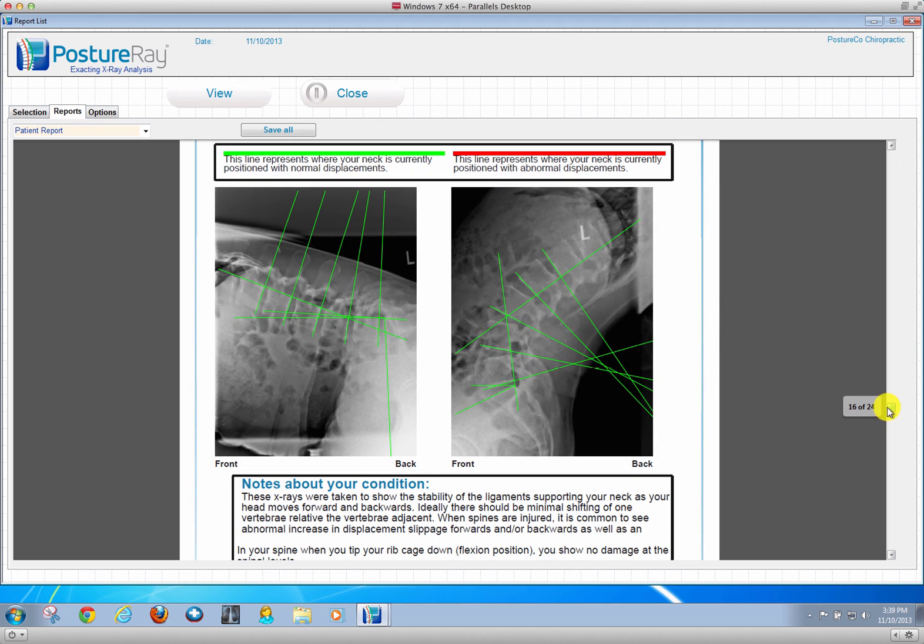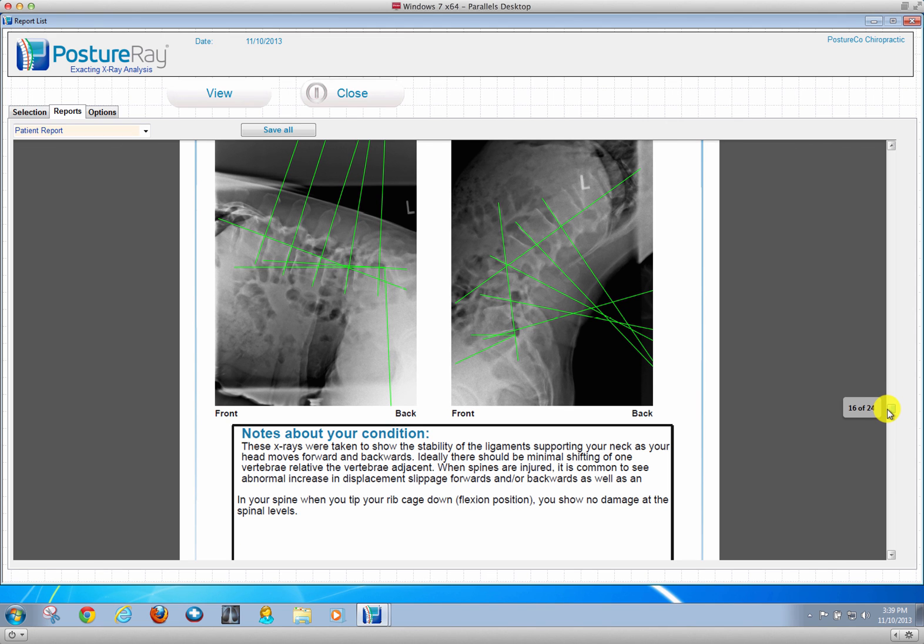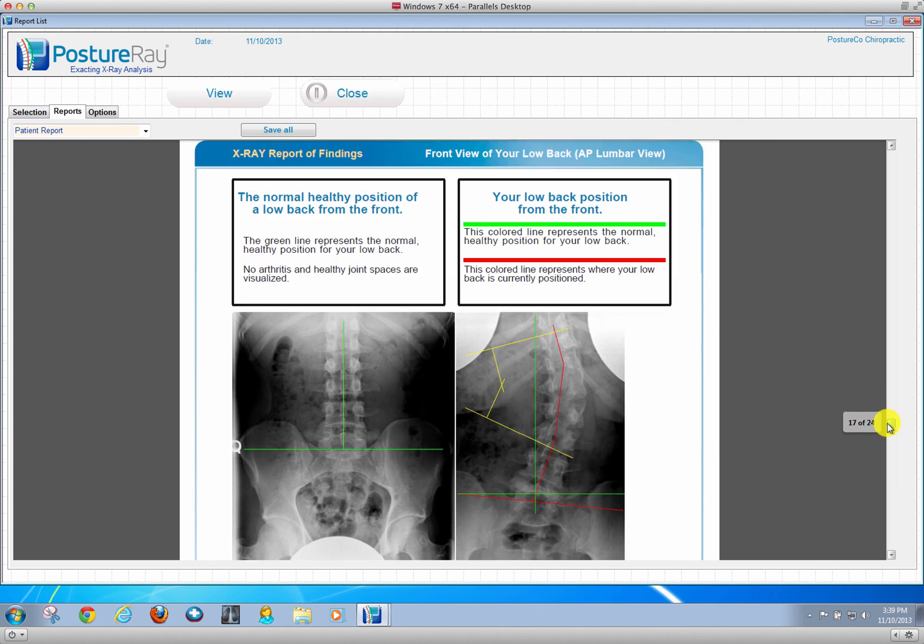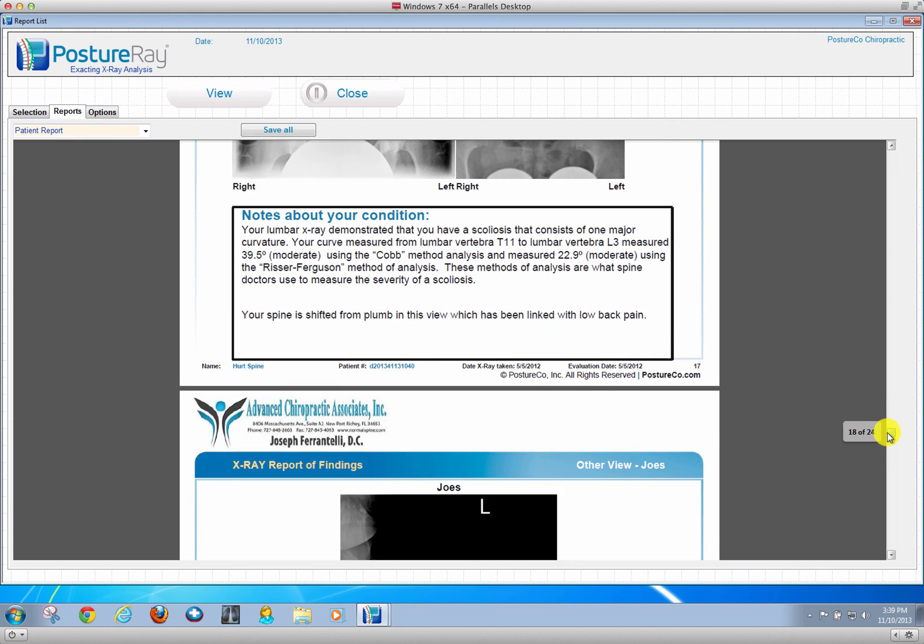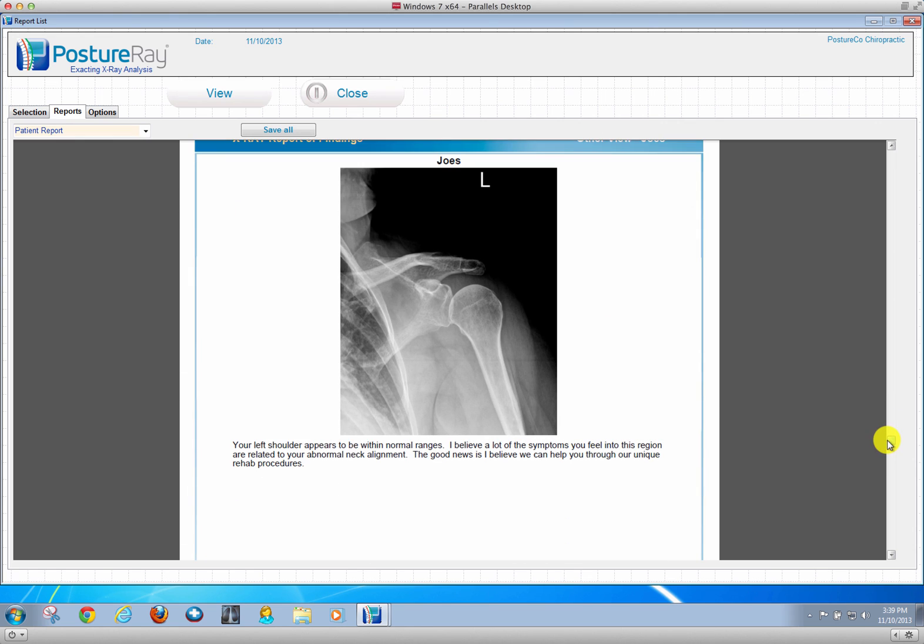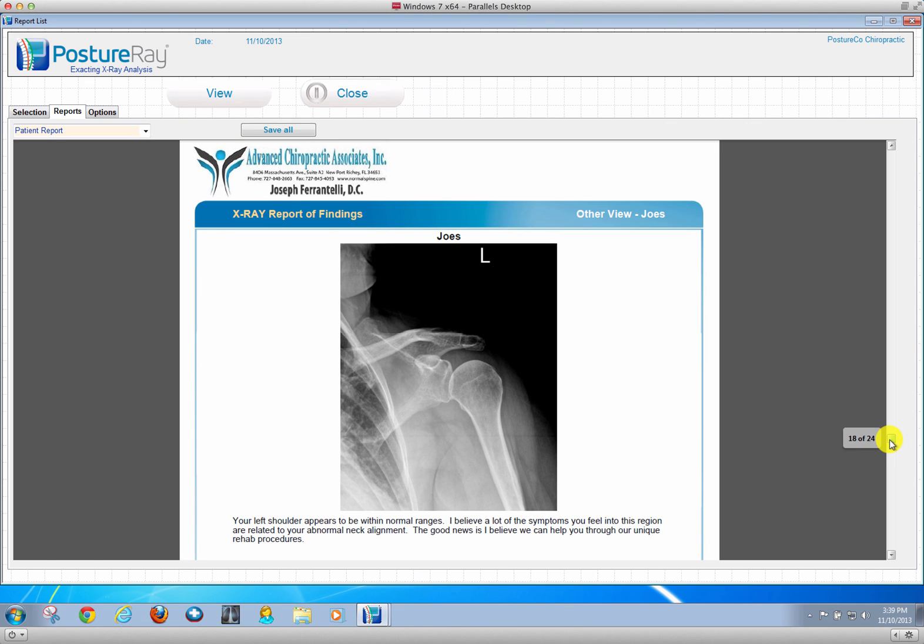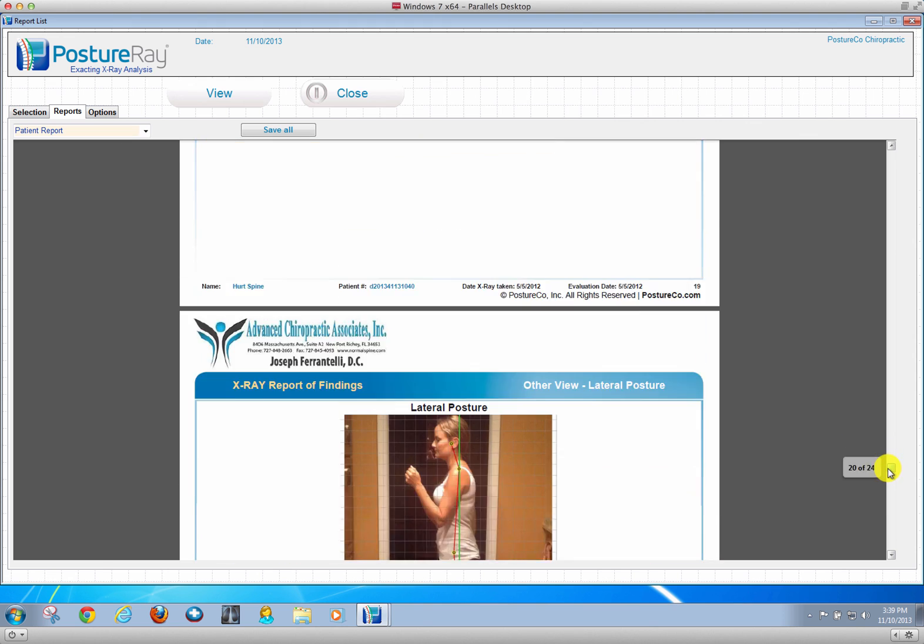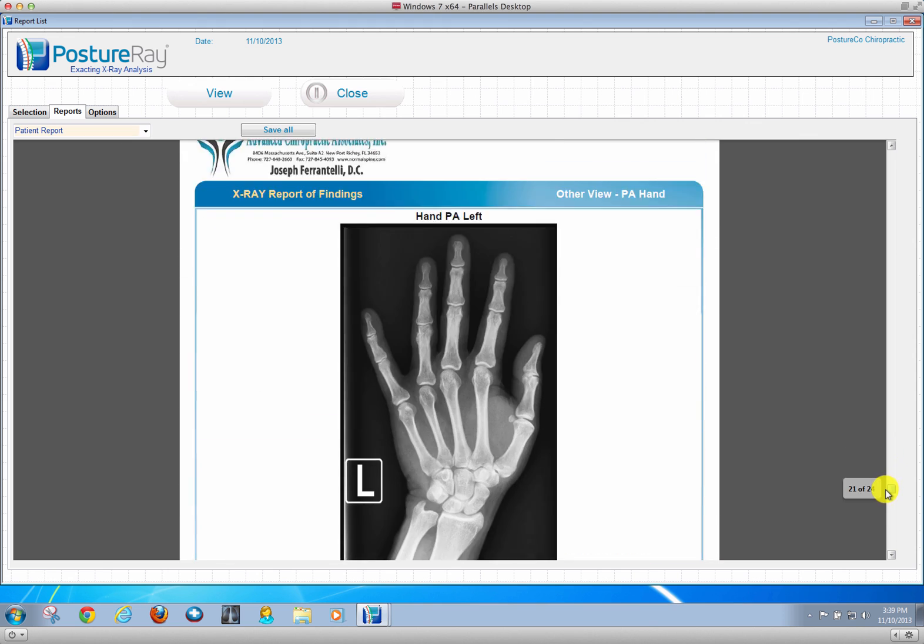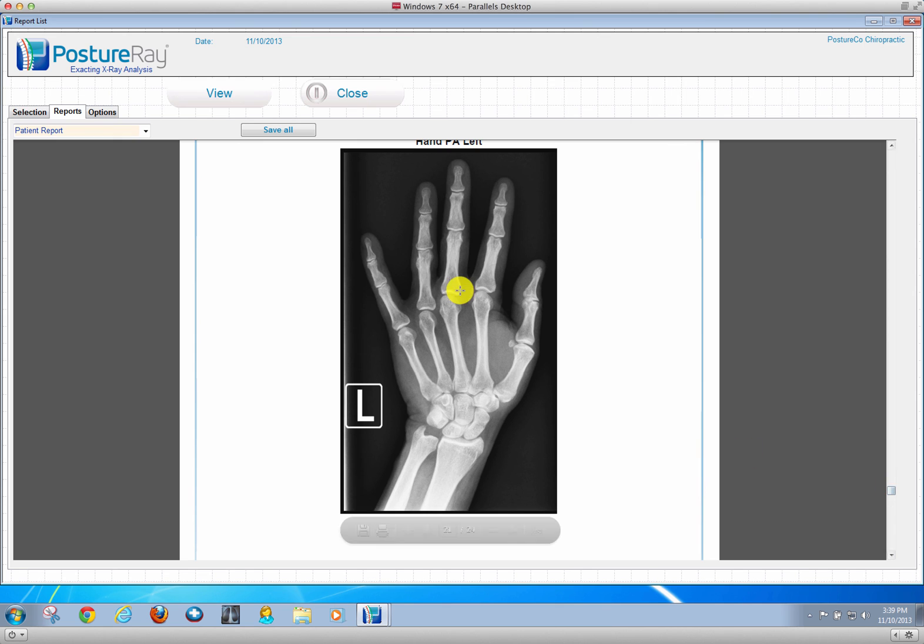If we had flexion extension, now obviously these are all different patient x-rays that I'm using for this example, just to show you some various measurements. You can store other x-rays in PostureRay for patient education and documentation as well. Here we have a shoulder series, you can put their postures in there as well, and there's a hand as well.